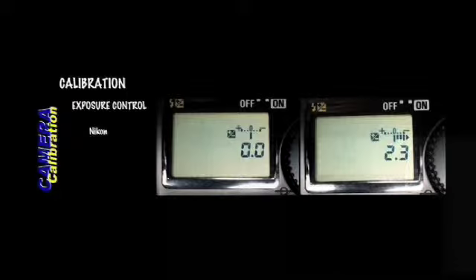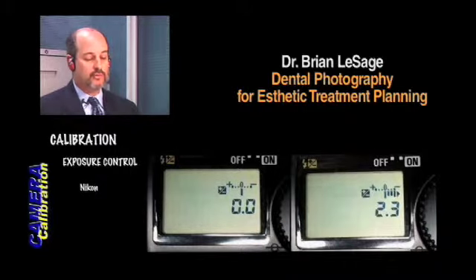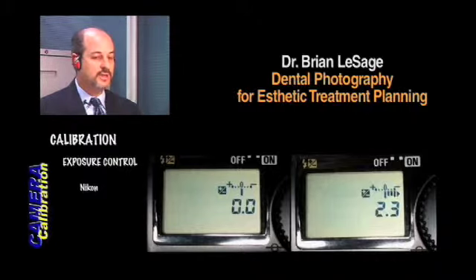Well, it's in different places on different cameras, but it usually shows up on the top line here in the AV mode, aperture priority mode. So you'll see your f-stop, and there's a little knob pretty much right here. You'll spin, and you'll be able to change your f-stop. And you'll want to remember those key numbers. The f-stops for full faces are smaller, usually a 5.6 to 8, something like that. And then the 1 to 2s is usually 22 at a minimum, 27 to 32 really are the f-stops for the 1 to 2s and the 1 to 1s.